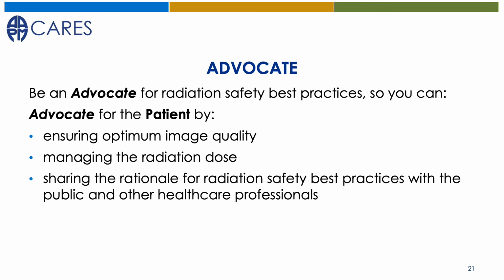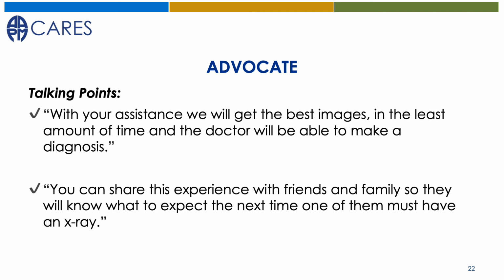A is for advocate. Advocate for the patient and the profession by practicing and sharing what you know about radiation safety best practices. We cannot overemphasize communicate, communicate, communicate.